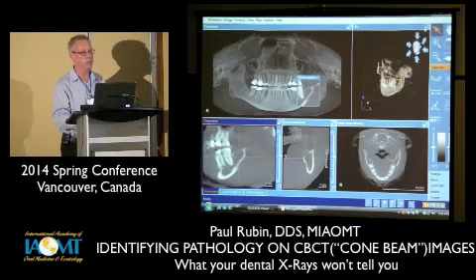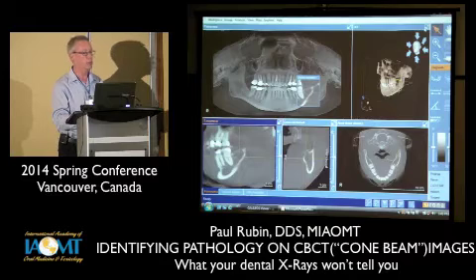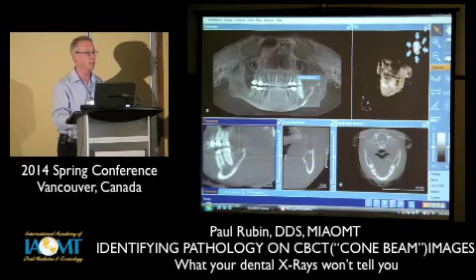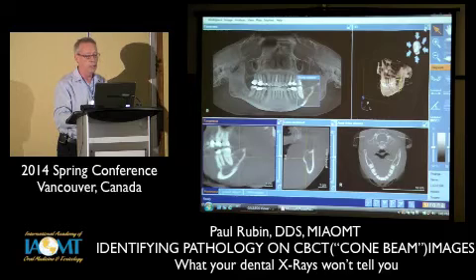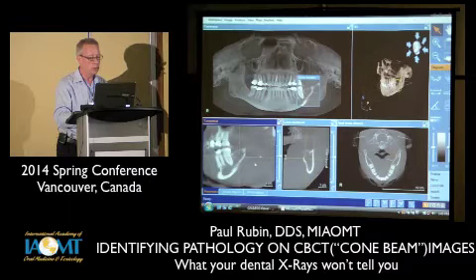Again, can you diagnose cavitational osteonecrosis by an x-ray only? It may be a matter of semantics. That may not be quite fair. What you're seeing is radiographic abnormality. I think that's kind of all we need to look at here.